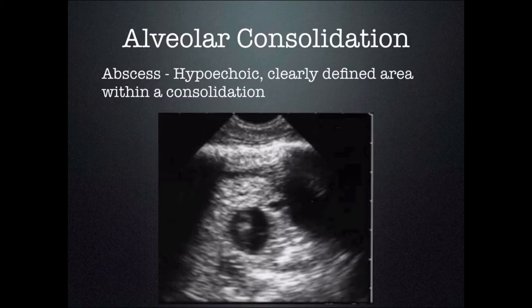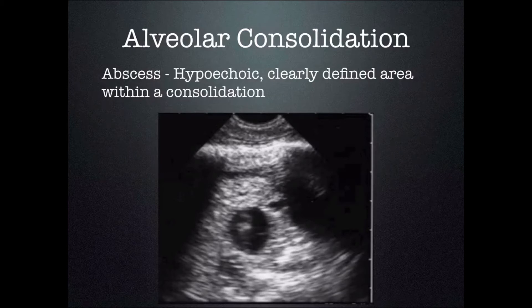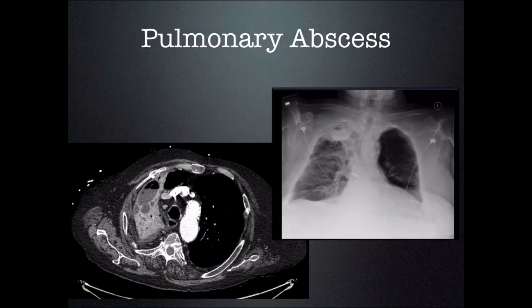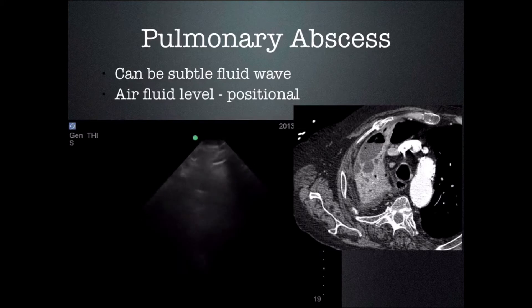Occasionally when looking at a consolidation you will see something within it — a hypoechoic area that does not match an anatomical structure would be very worrisome. In this case we're looking at an abscess, which is a hypoechoic clearly defined area within the consolidation. It doesn't match an artery or a vein, so you know it is not a normal structure — this is liquefaction of the lungs. We can see it on CT scan and chest X-ray as an air-fluid level, though not all abscesses will have an air-fluid level.